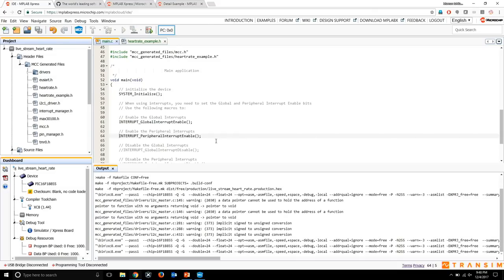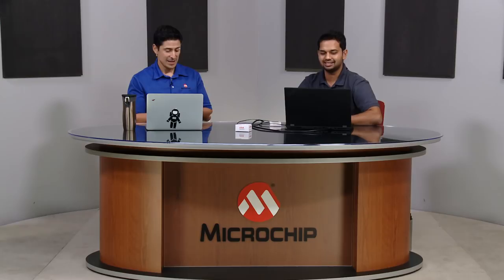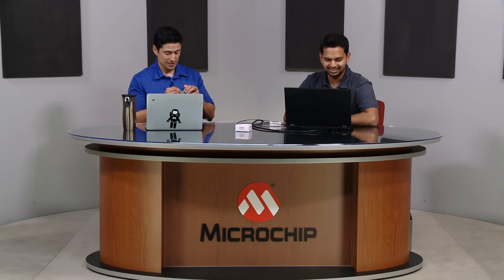At this point, if we have done everything correctly, I am just going to hit the make and program device icon, and it should compile. And after that, we're going to plug it in, and program the board and see how it works. All right, so it's compiling, and let's see.